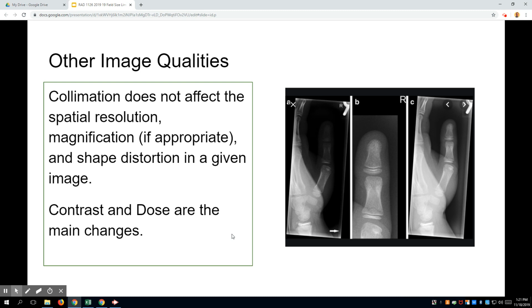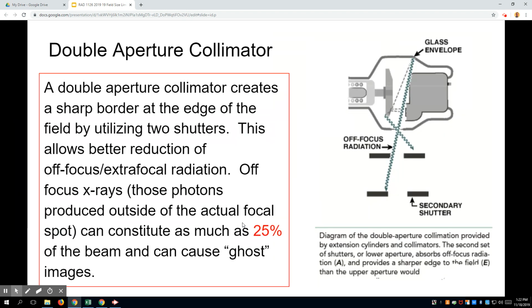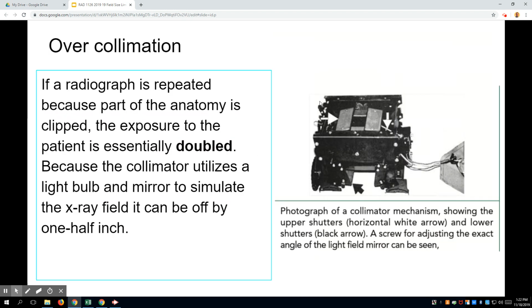One of the reasons we don't do that now is your exposure indicator goes crazy. And it's really a digital issue. It's not about saving film the way it was, right? Back in the day, I hate to say that, the idea was you put multiple views on one piece of film instead of using 3 pieces of film, and you saved some money. Processing time, for sure. Yeah, when you had a 90-second processor. So repeating is not good, and hopefully that's happening a lot less because you actually cut the anatomy, right?